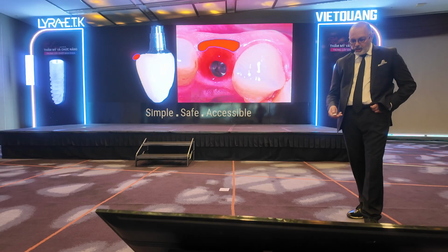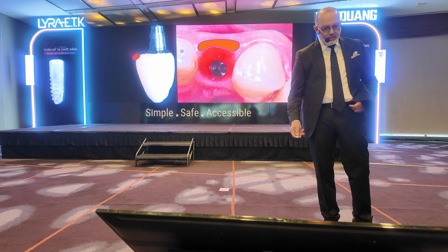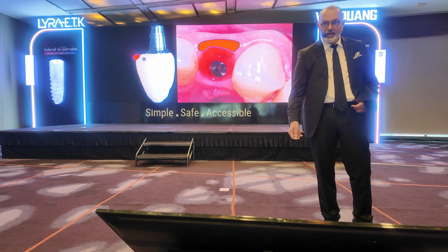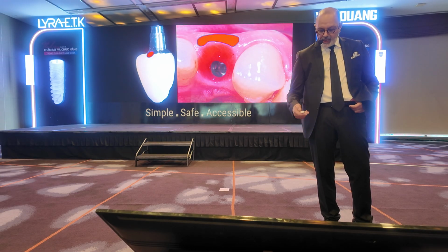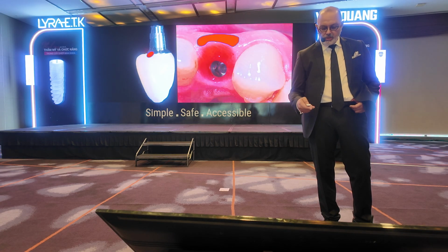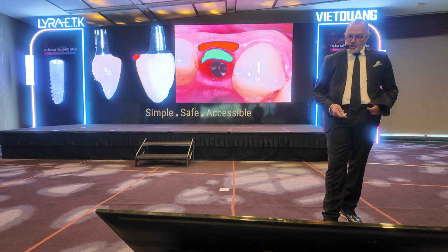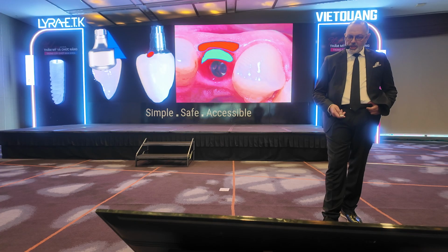So never push here, never, never ever. And this is what you do when you use this kind of shape, convex and concave. You need to push down. If you do that, you have a recession, with no doubt. If you use a pushing technique inside, this is the only way to avoid the recession.